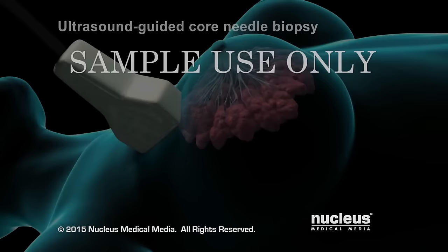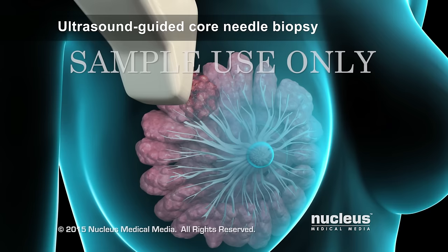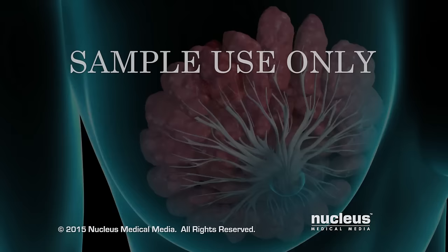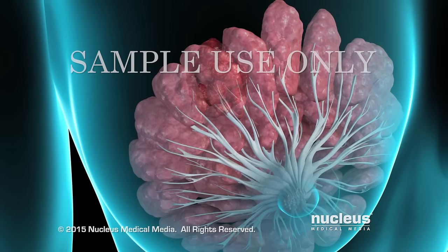During an ultrasound-guided core needle biopsy, your doctor will use an ultrasound probe to locate the area of concern. A hollow needle will be inserted to remove several cores of tissue. Fine needle aspiration and core needle biopsies involve removing small samples of fluid or tissue using a needle.